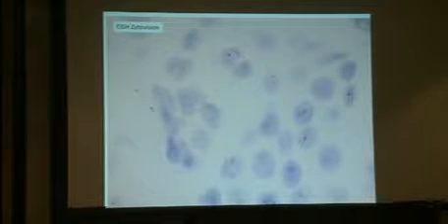So when you are not sure, like this one, maybe you have two cells. So not to overestimate the level of HER2 copies, you shouldn't count such a cell. It's the same thing here. You don't know if you have one cell or two cells. So when you have any doubt like that, you shouldn't score this type of cells.